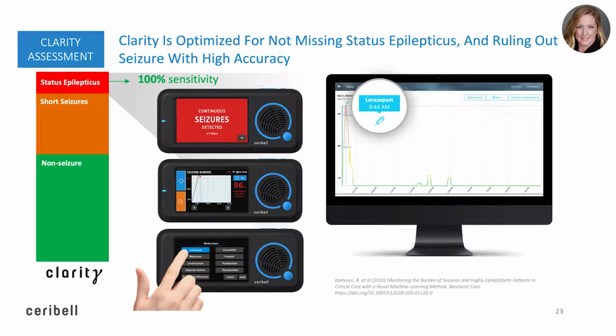If medication is ordered, please continue as you normally would. Pull, scan, and administer the medication per the order. As you are monitoring the effect of your medication on the seizure burden screen, please use the orange flag tool on the lower left and select the medication given. This action helps provide information to the reading neurologist or epileptologist.